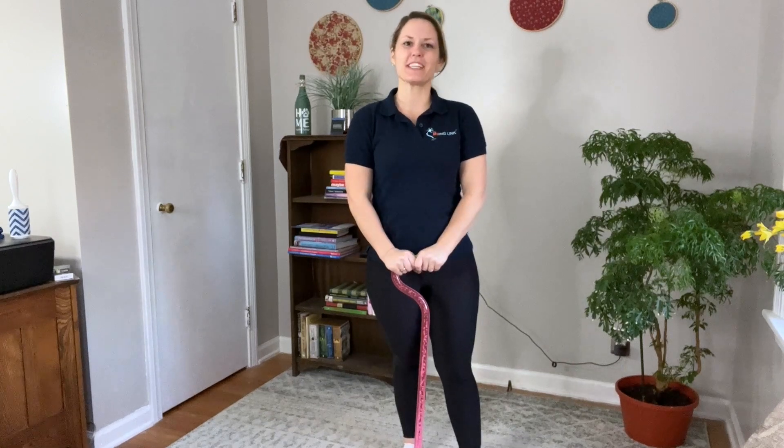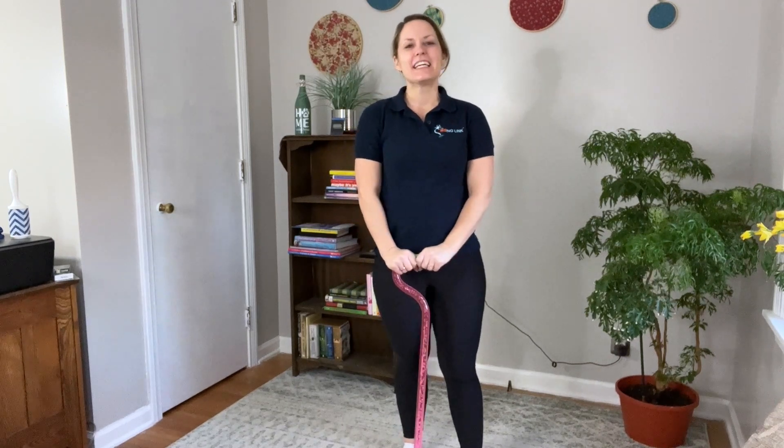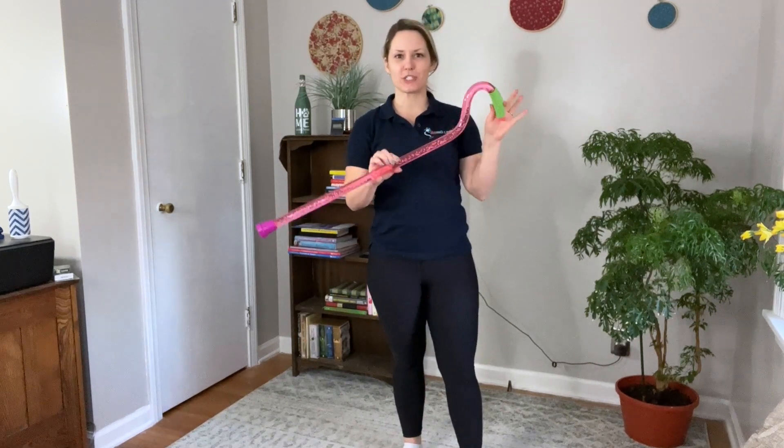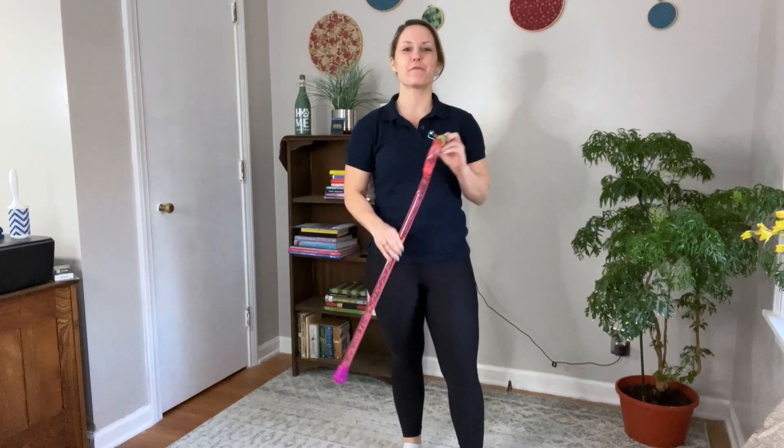Hi everyone, my name is Dr. Gretchen Hawley. I am a physical therapist and a multiple sclerosis certified specialist at The Missing Link. I wanted to record a quick video for you today to share with you how you should be measuring in order to get the appropriate walking stick height for you.